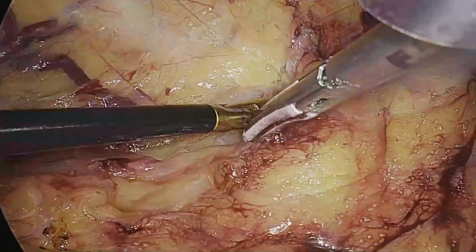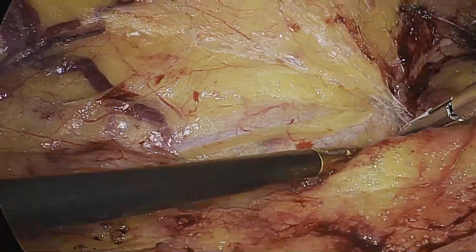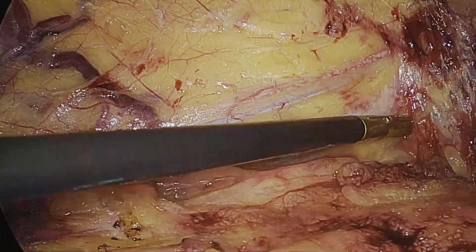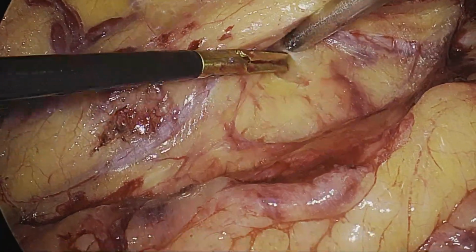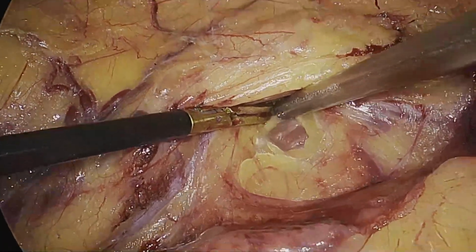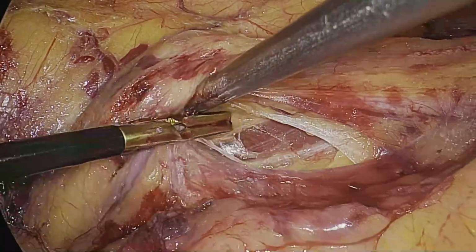These vessels tend to bleed very profusely. If ruptured or if any mistake happens, it gets really difficult to control the bleeding, because these channels are not in a regular direction. They are haphazard and can bleed very profusely.